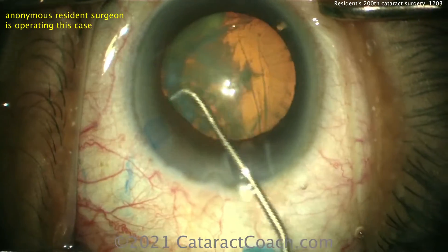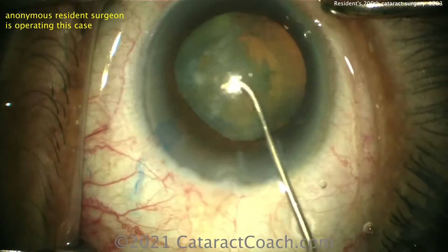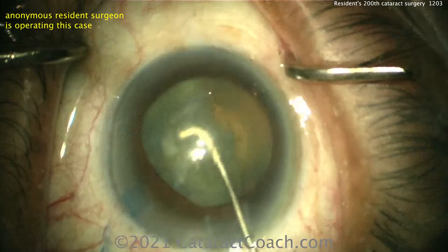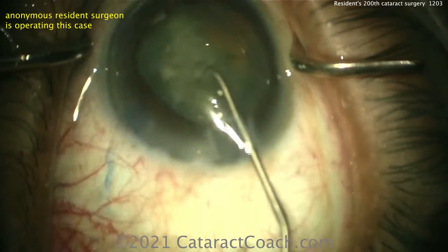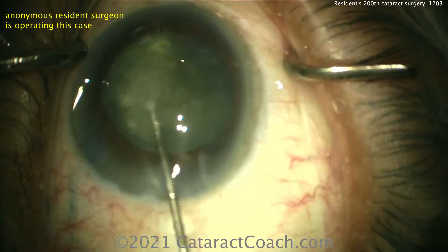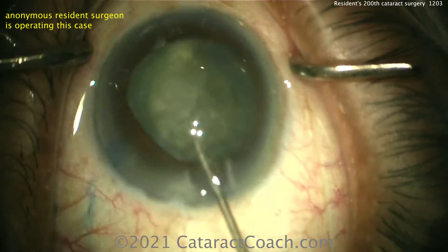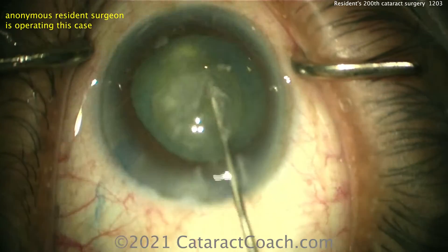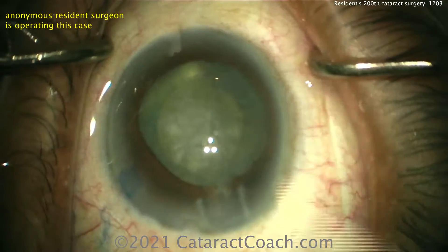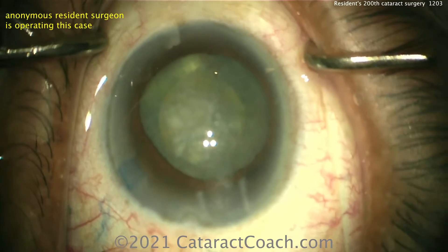Let's see the hydrodissection here. It's hard to see if a wave goes through. If you go on the other side instead, where you have less cortical opacity, you'll be able to see the fluid wave go across a lot easier. This is a very common scenario with cortical whiteouts — that liquefied lens material has been dispersed and the red reflex is lost.